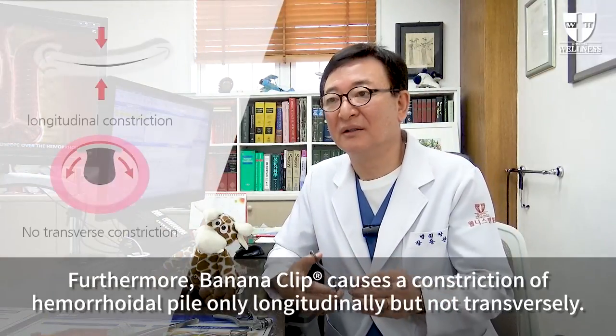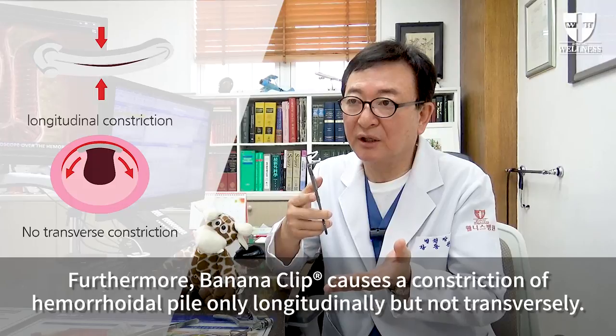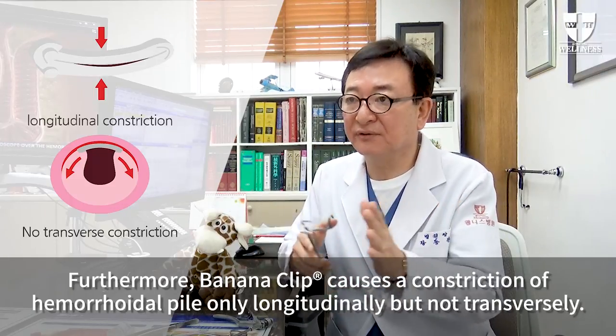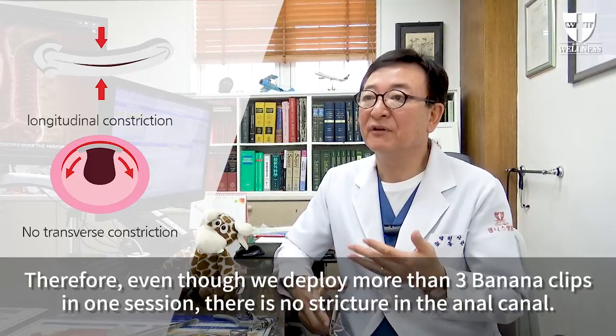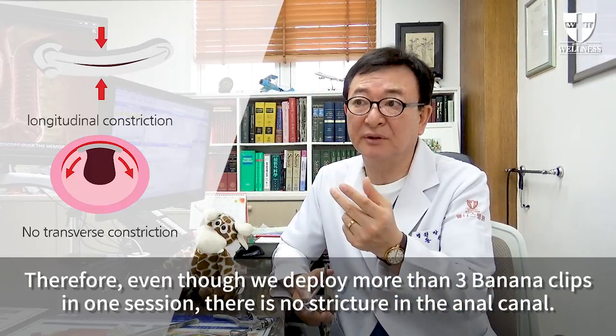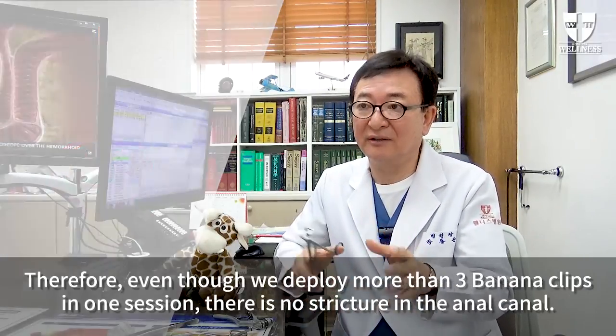Furthermore, banana clip causes constriction of hemorrhoidal pile only longitudinally but not transversely. Therefore, even though we deploy more than three banana clips in one session, there is no stricture in the anal canal.